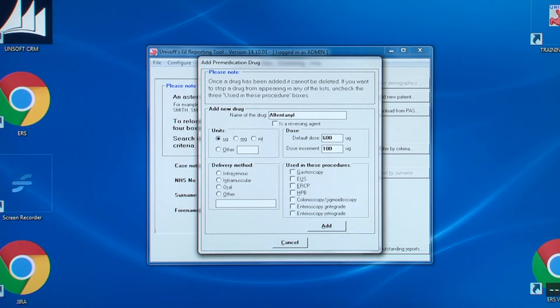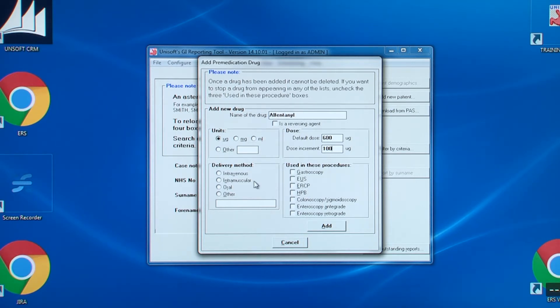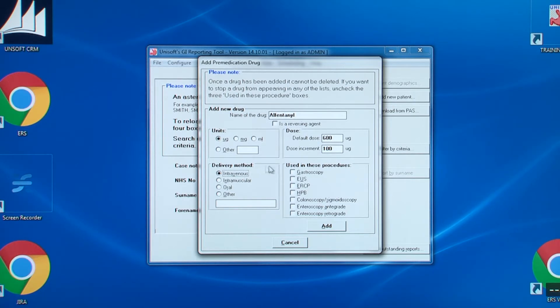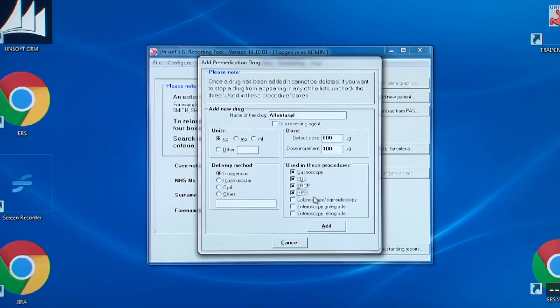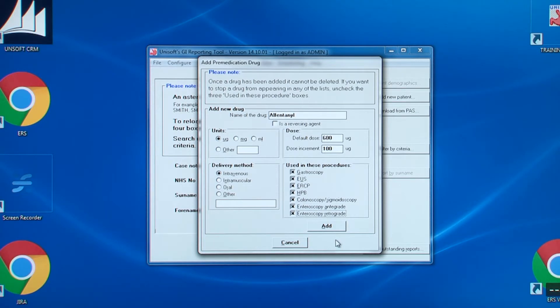Then there's the delivery method. And again, other can be something like spray, enema or topical. And finally, you click the procedures it can be used in. We now click add and we can see that this has been entered into the list.